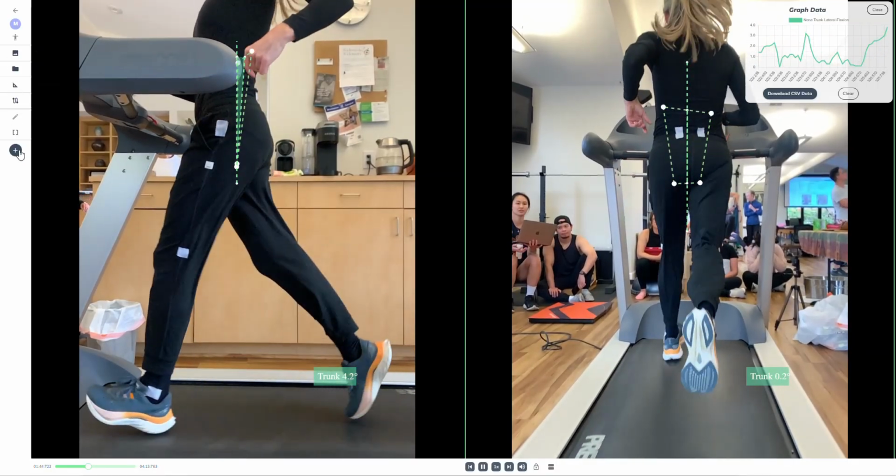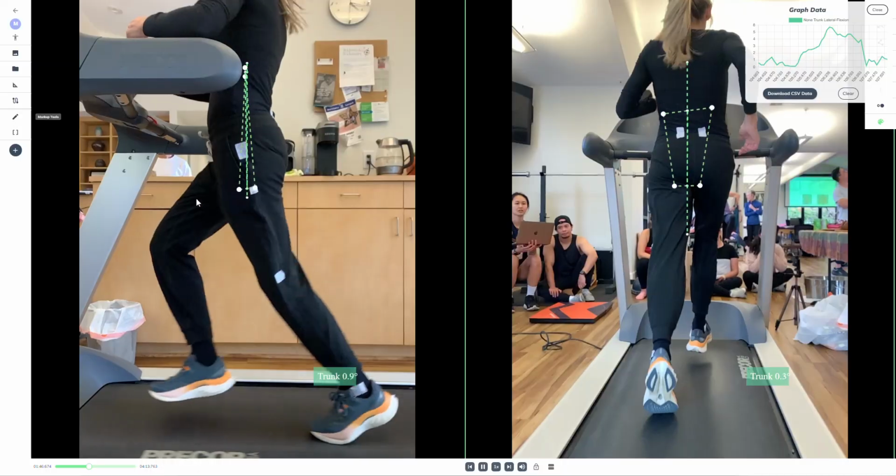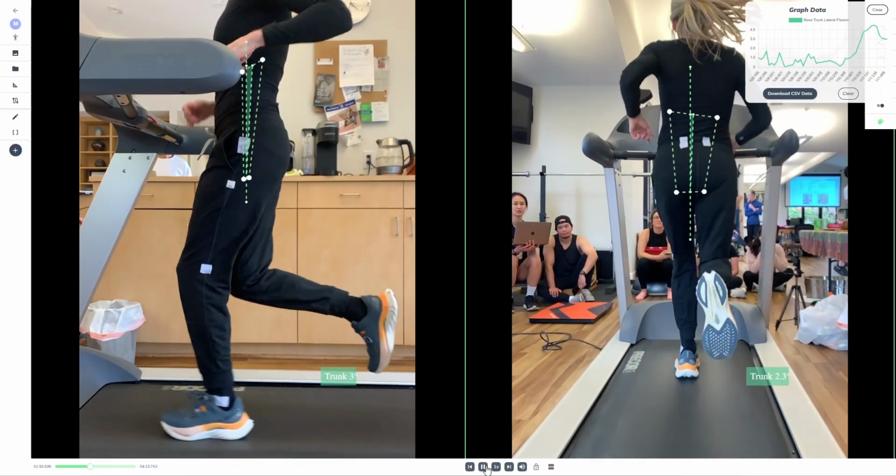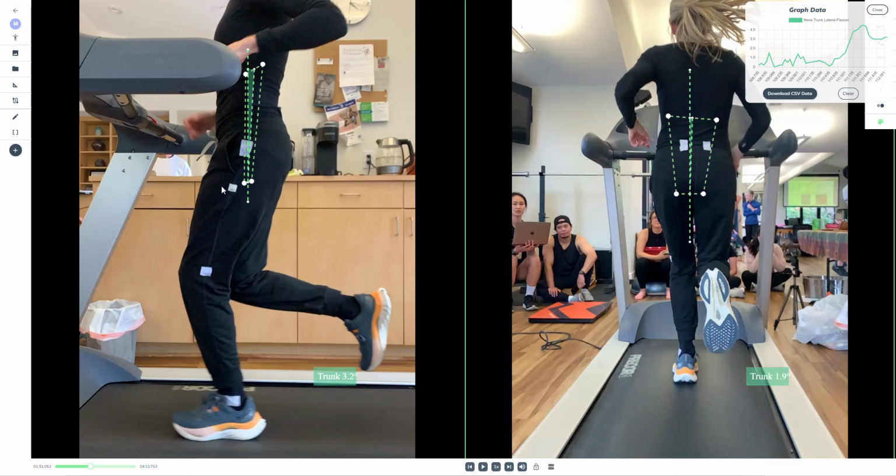The feature that I ended up using was the markup, where you can pause the video. We'll do it here for the knee, where you would just draw in. We've already put stickies on her to improve the accuracy of hitting the joint angle: the greater trochanter, lateral femoral condyle, and the lateral malleolus. So that is the first piece of software we will use.